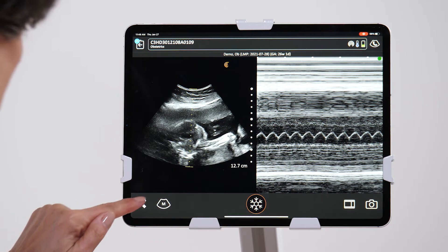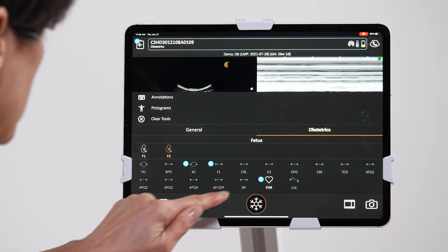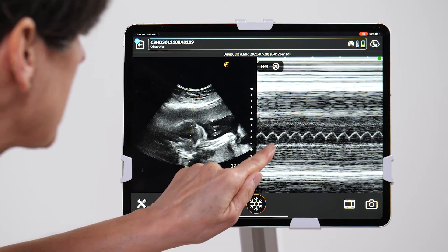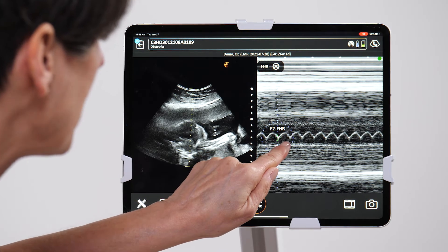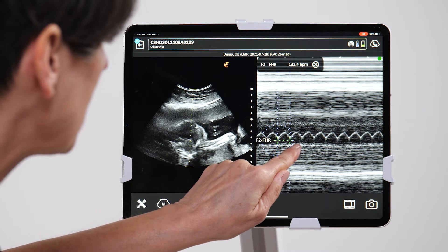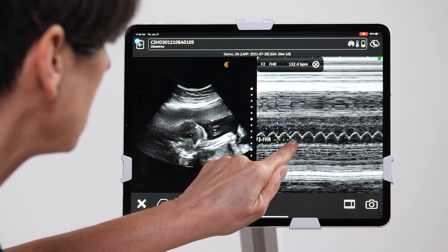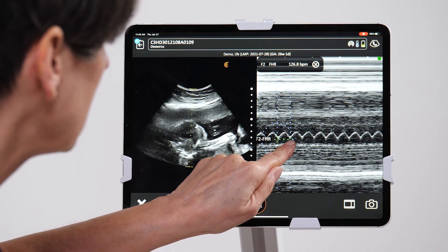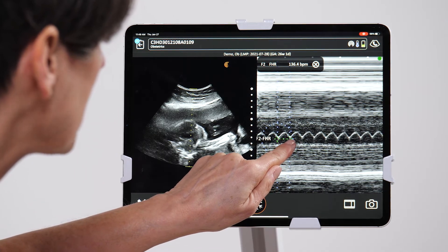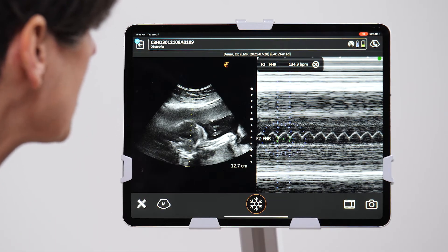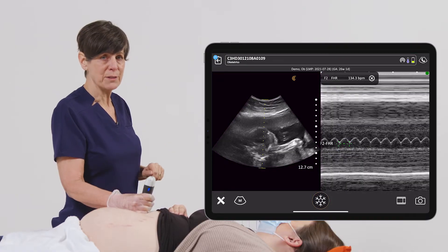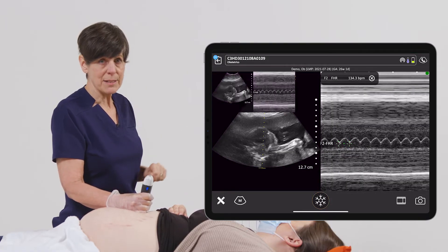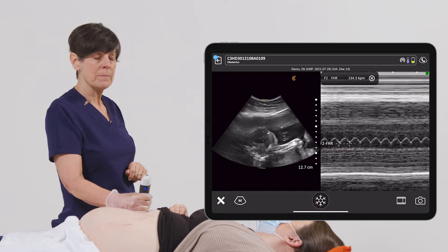From here, we can go into the measurement icon, select fetal heart, and measure one of the peaks. You can always make some fine-tuned adjustments, and we're getting a heart rate of 134. So I'm going to take a picture of that to make sure that it goes into the report.